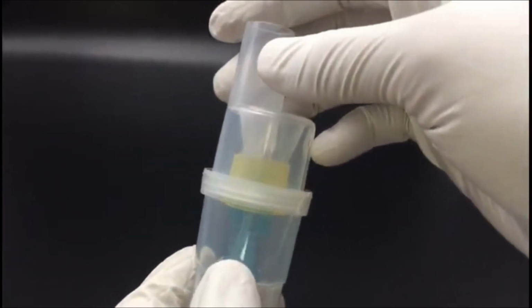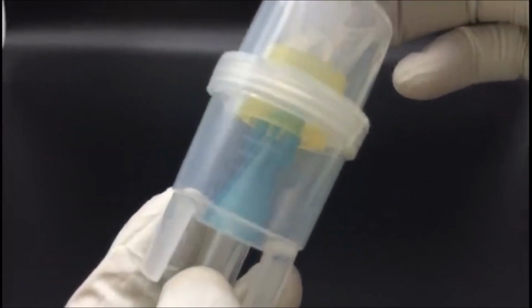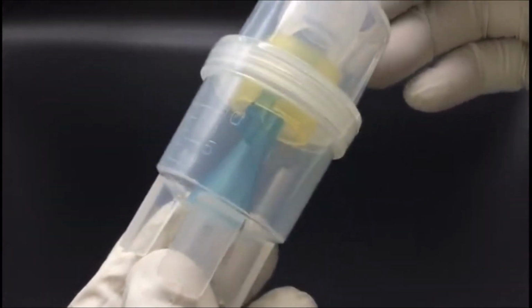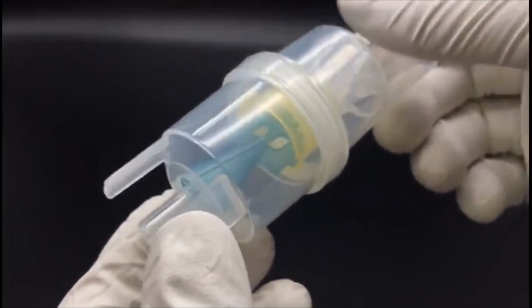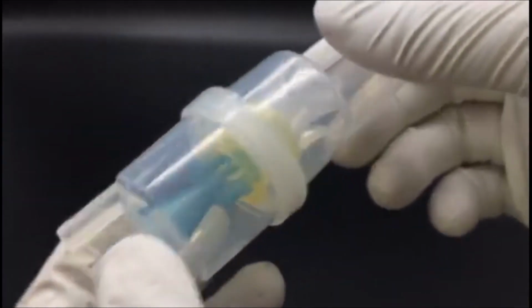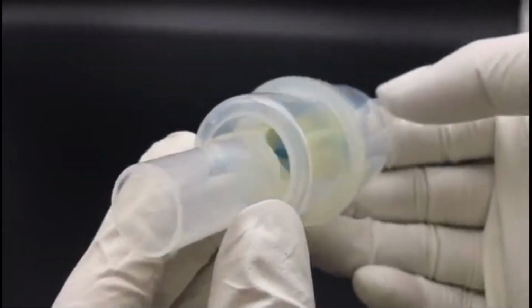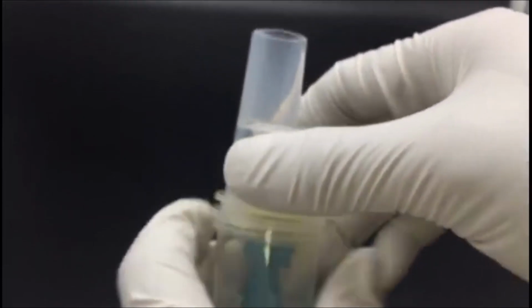You may also need to disinfect your nebulizer weekly. Disinfect the mouthpiece or mask, medicine cup, and top piece. You can disinfect them by soaking them in a solution of white vinegar and water for 30 minutes, boiling or microwaving them for 5 minutes, or using a dishwasher. Follow the instructions provided by the nebulizer manufacturer. Rinse and air dry the pieces in a cool, dry place. Wipe the outside of the machine with a cloth as needed.